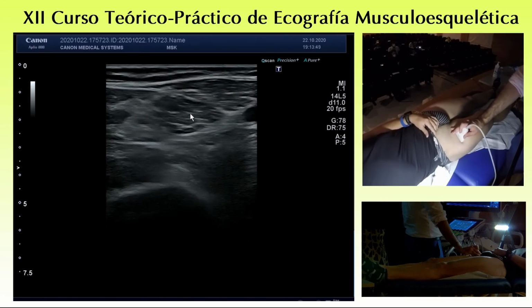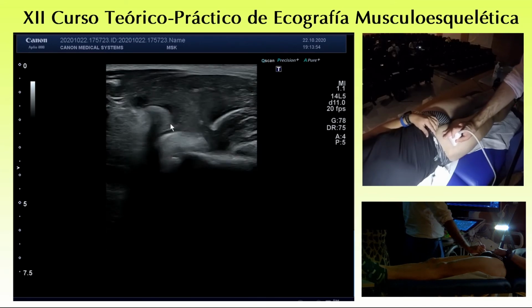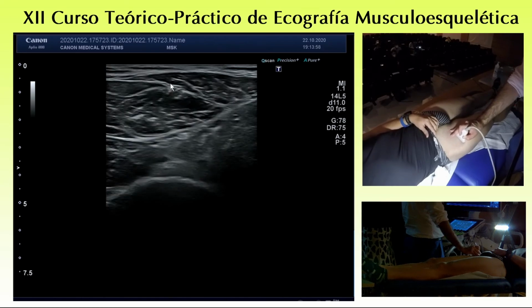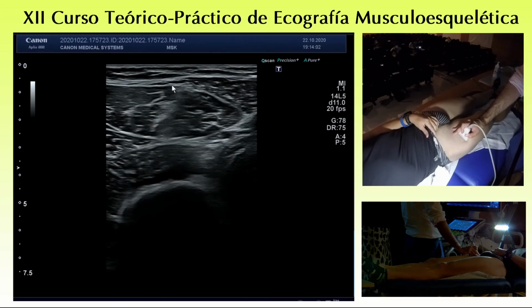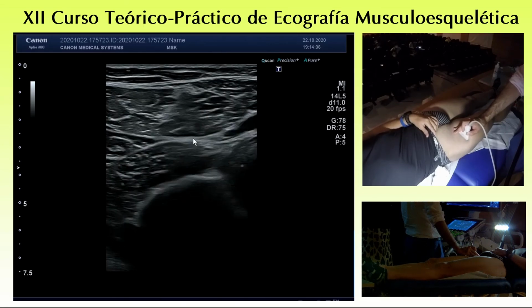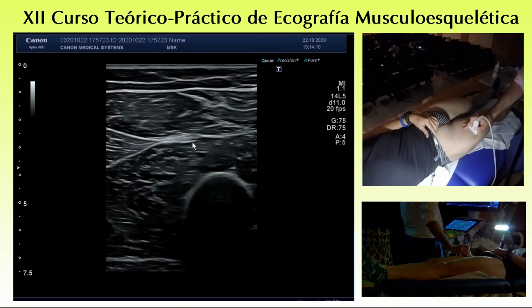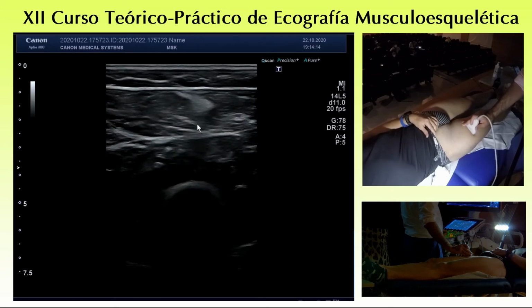In the direct part, the direct tendon, it's been described as a myotendinous junction, just very eccentric, very superficial, at this level. Instead, on the lower level, you have the myotendinous junction in common with the vastus intermedius.